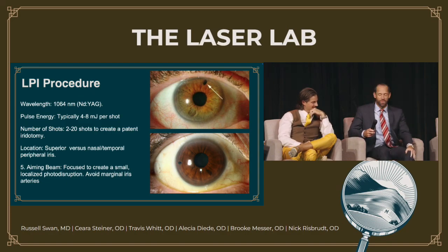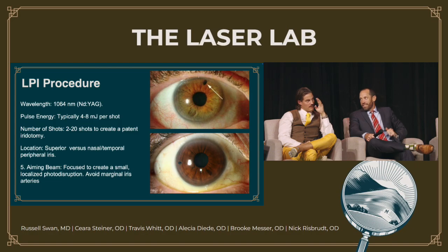Well, wait, right or left eye? Because that would be nasal or temporal, depending on the eye. Well, point at my left eye, which would be left eye. Superior, looking at nasal. It'd be like 9/30/10.